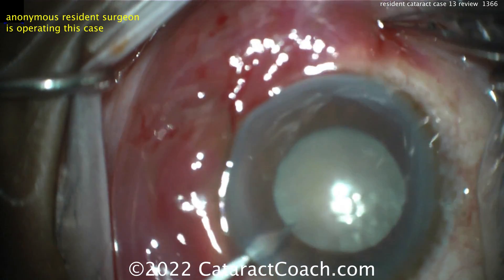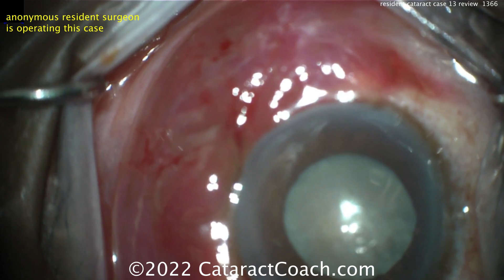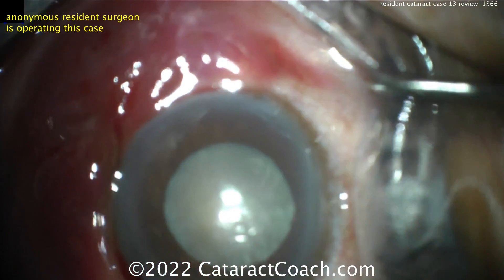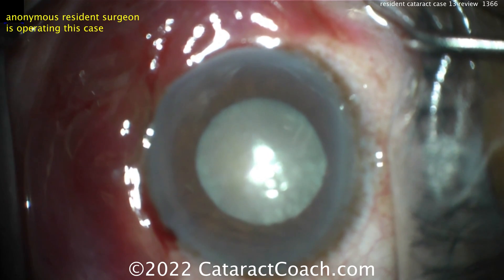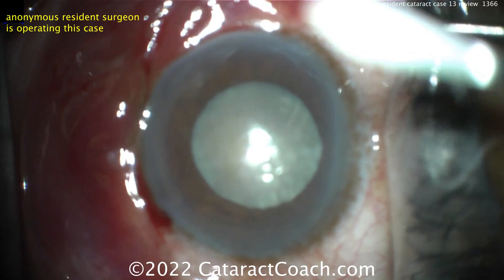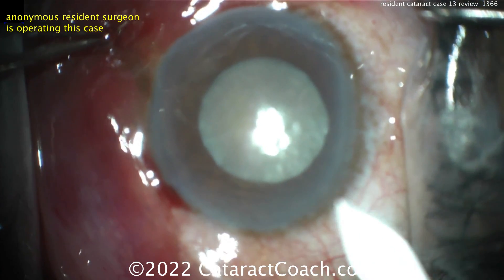We're starting off making that first paracentesis. You can see there's a lot of subconjunctival chemosis and bleeding — that's probably from a retrobulbar block. The pupil size is a bit on the small side, probably at most a 5mm pupil. The cataract looks pretty opaque, pretty dense. So this is not going to be a simple case.